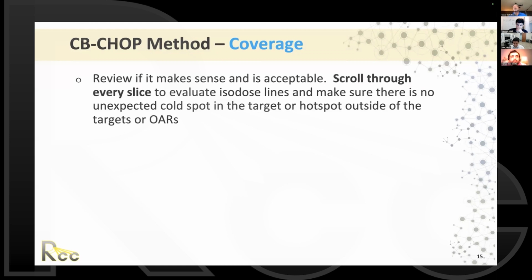So when you design your fields, you need to make sure you avoid the shoulders, so the radiation gets to those targets that are between the shoulders and the entry. Yes, it's a good question, because immobilization devices, as in any type of treatment, not only head and neck, are very, very important. You want to make sure that everything is reproducible.